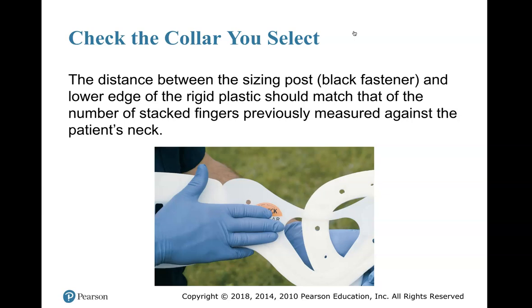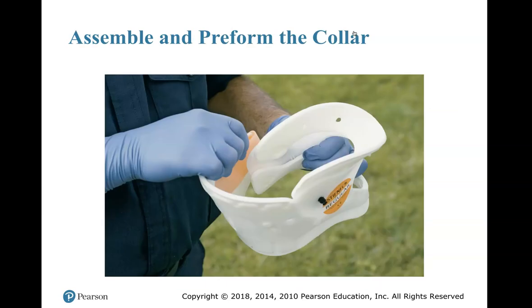A lot of different collars out there. So whenever you go to work for your company, you need to pull one out, look at it, figure out how to measure it, because you're going to look like a total idiot on scene. I don't know if I'm trying to offend you, but it happens to everybody, so don't worry about it. Trying to size up that C-collar, and your partner's saying, come on, get the C-collar on, and we're trying to get out of here, and you don't even know how to use it. So please familiarize yourself with your equipment, because that is not the only C-collar they make in this picture. Trust me, I guarantee you that is not the only C-collar they make.